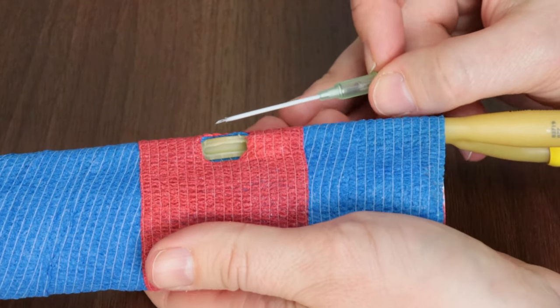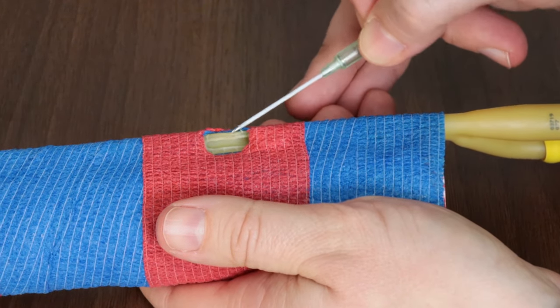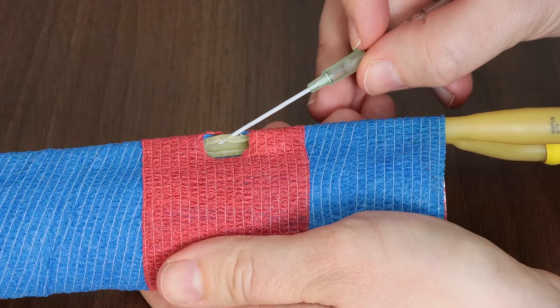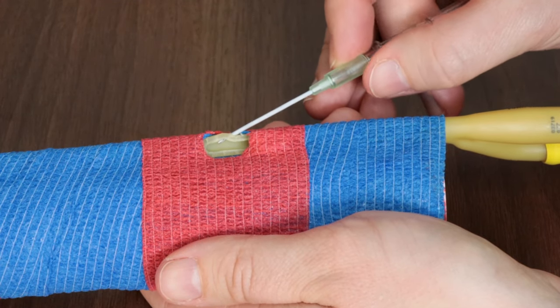The reason why I'm bringing this to your attention is that once the beveled edge is into the vein, and let me get it lodged into my dummy here, you can see it on the edge of the vein there. That's where you get that first flash of blood coming back.